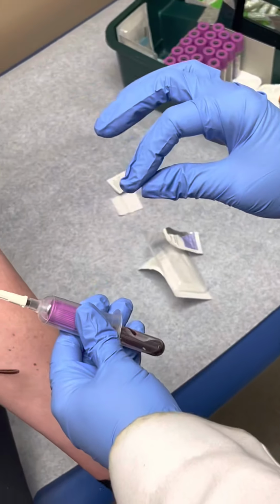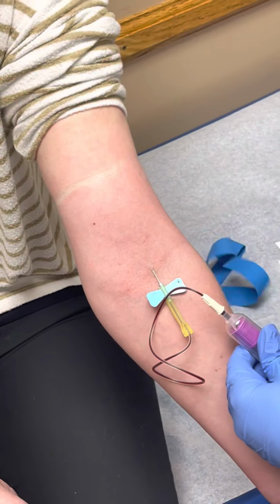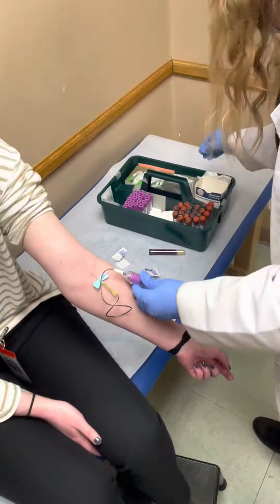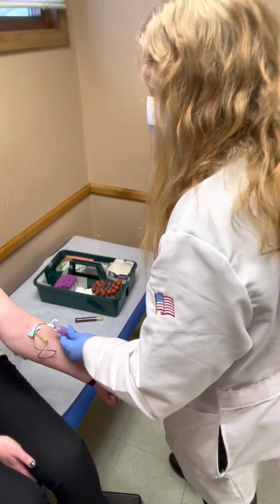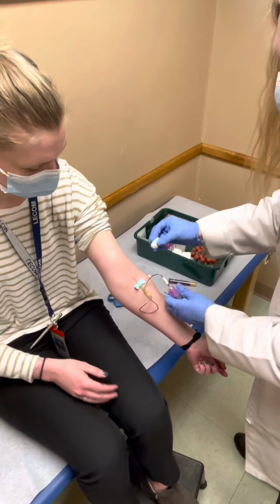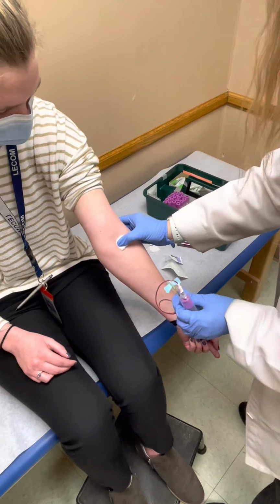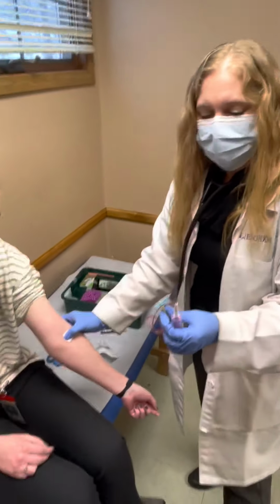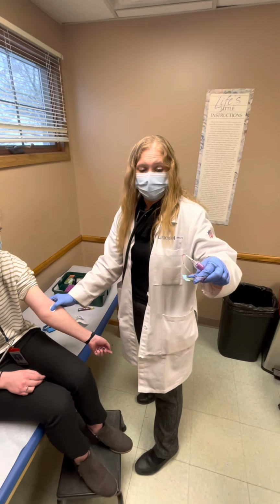Now, the most important thing when we're done drawing blood is that we take the tourniquet off first. Then we apply pressure with gauze. Can you hand me a cotton ball? With gauze, you do not want to use the alcohol swab because that will not allow it to clot. So you're going to apply pressure above, and you want to pull it out fast so that way they don't feel anything. I make sure that the tube is not completely filled, that way it doesn't drip blood out the end.